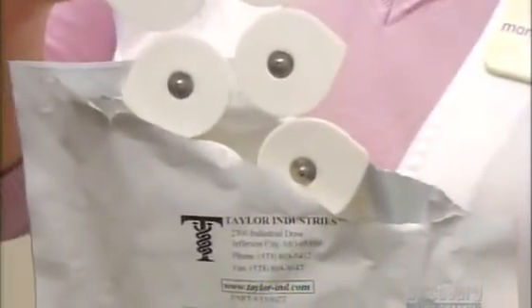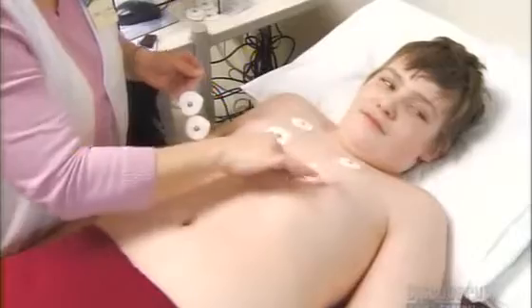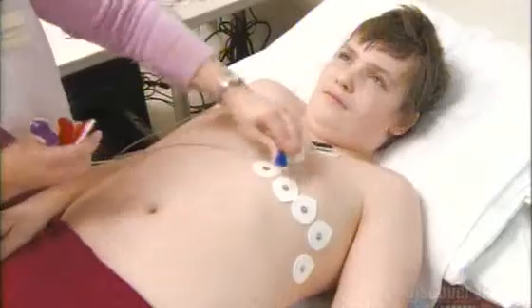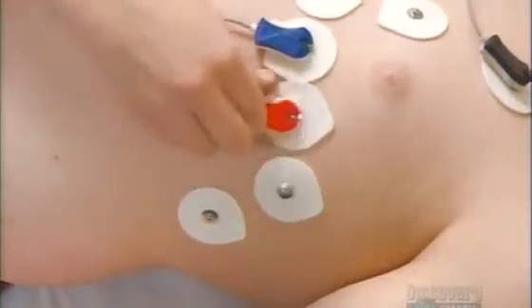When the nurse says this won't hurt a bit, you can trust her if the test she's about to give you involves medical electrodes. These electrodes stick to the skin and probe beneath the surface without actually piercing it. They send information to monitoring equipment so specialists can assess it.